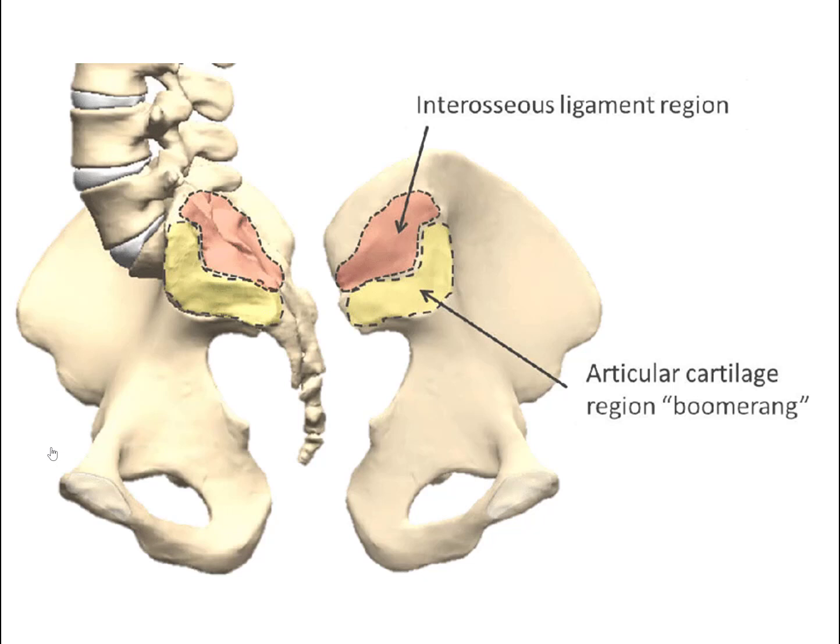I wanted to make sure the needle was in the joint, and you can only put a cc or so in there. They would do an arthrogram. They would actually put dye in. It is an arthrogram, but I just want to see the CT cut with that needle in the joint inferiorly. And then I knew they were there. It would extravasate because the capsule is kind of insufficient, and it takes multiple attempts to get it in there.